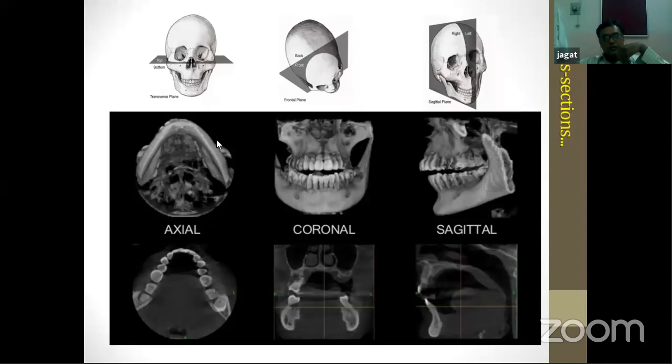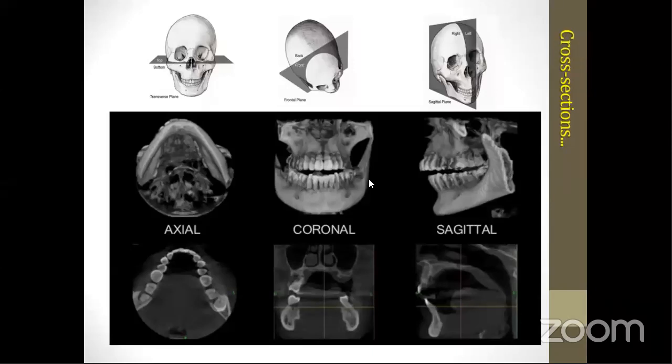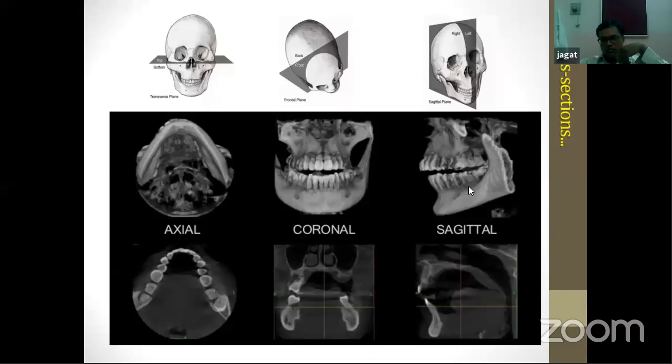So these are basically toys. Most of us get excited about having these reconstructed models, and when you turn them, they turn around all angles, you can look into it. These are basically toys. These are not meant for diagnostic purposes. These are meant for patient education. They're more like the models that you show in your clinic to teach patients to brush their teeth, something like that. This is understandable for the patient, the patient's language, whereas this is the doctor's language.